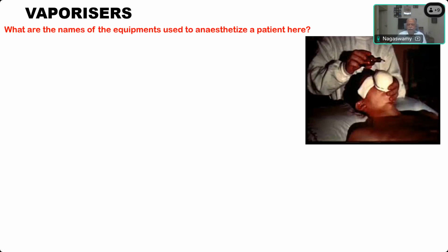So it increases the surface available for vaporization by having the gauze. Is it better to use a closely woven cloth, or is it better to use a gauze piece? Many layers of gauze piece. Many layers of gauze pieces, because there is a gap there and the surface for vaporization will be more.